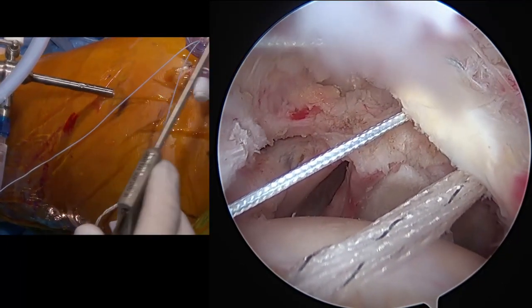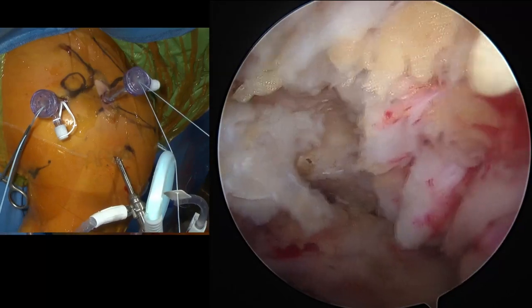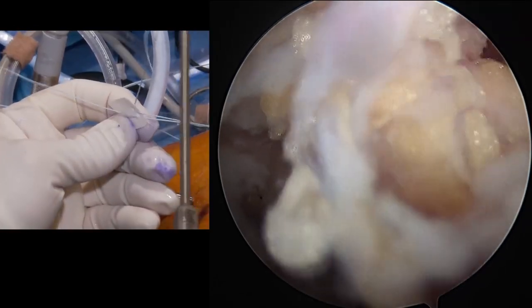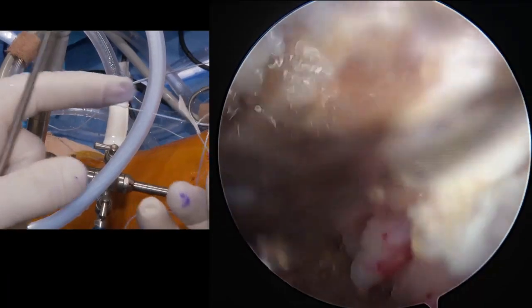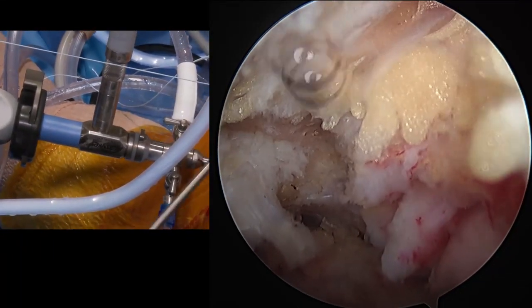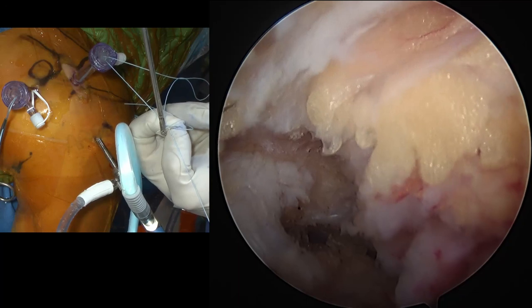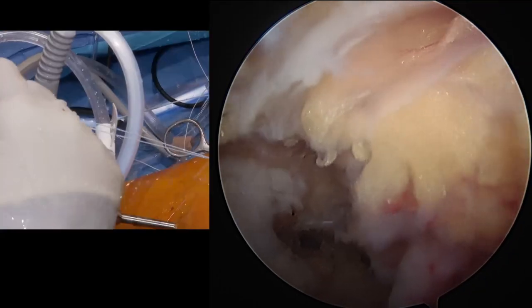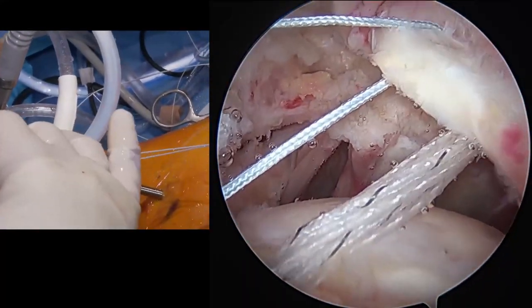And we'll just slide it down the two edges here. Hold this, please. This is just to kind of hold it in the general region there. Sorry. I know I got in your way. Let's have a knot pusher. Right there. Knot pusher. Thank you.